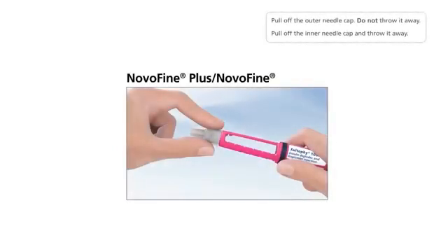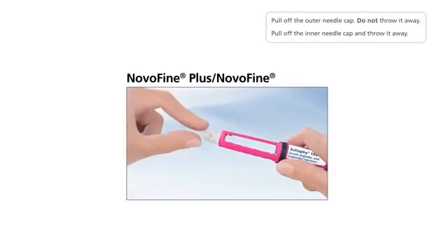Pull off the outer needle cap — do not throw it away. Pull off the inner needle cap and throw it away.